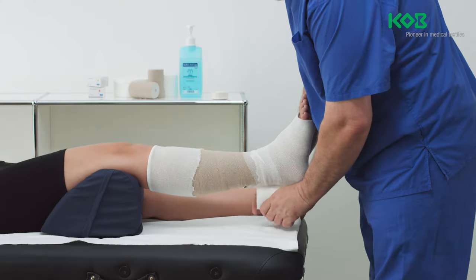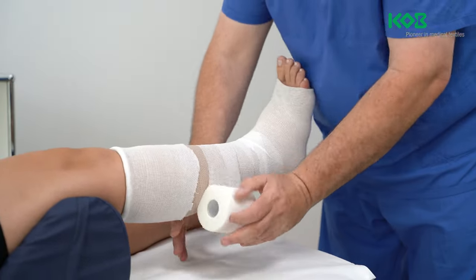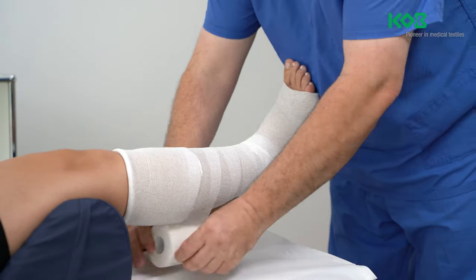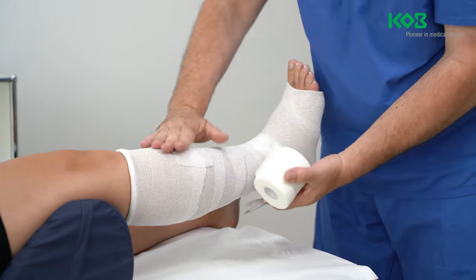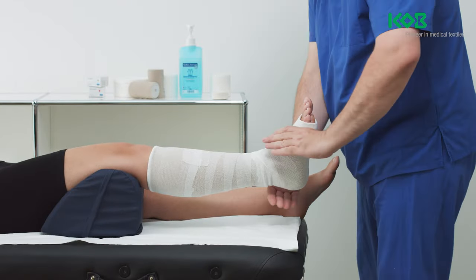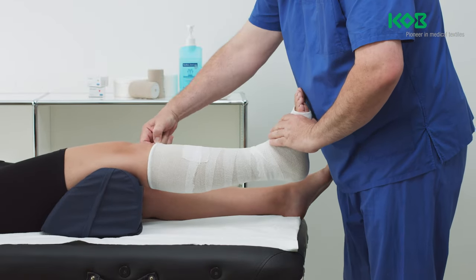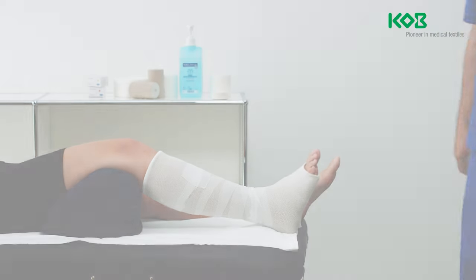Secure the ends of the tubular bandage by applying a self-adhesive bandage in a circular fashion. This procedure will ensure that the bandage turns remain stable and securely in place on the foot, heel and lower leg during exposure to shearing forces. Be aware that it may be necessary to adjust the application technique to suit the anatomic and pathophysiological characteristics of the patient.